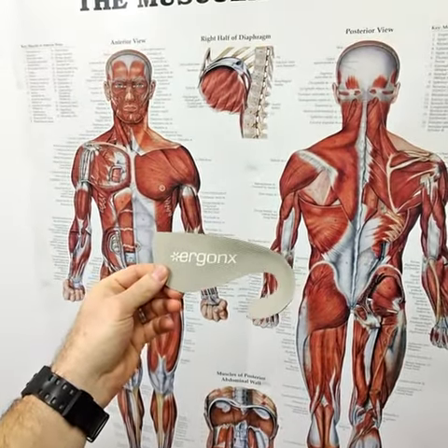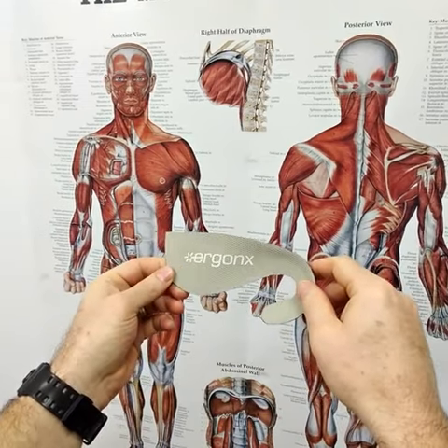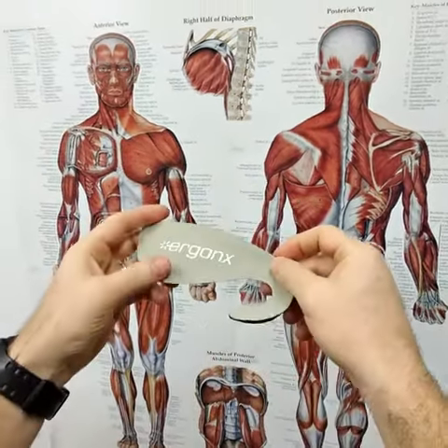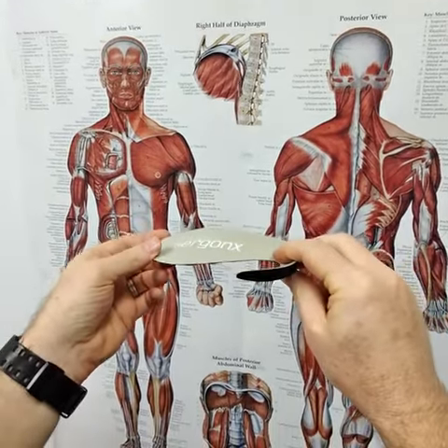Hi guys, today we're looking at the Ergonix Slimline, the hookback orthotic inner sole. This is the orthotic inner sole we use for people with heel pain, plantar fasciitis, heel spurs, and arch pain who are wearing fashion shoes that can't fit a regular orthotic into their shoe.